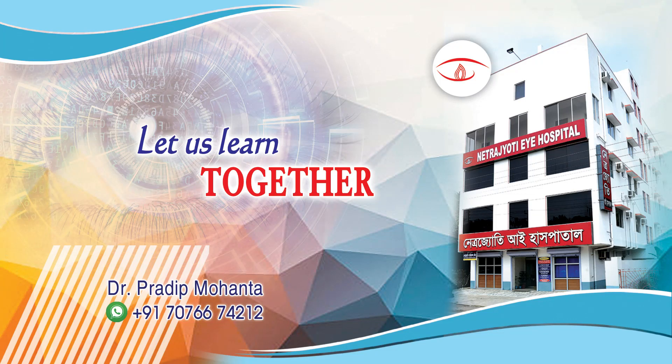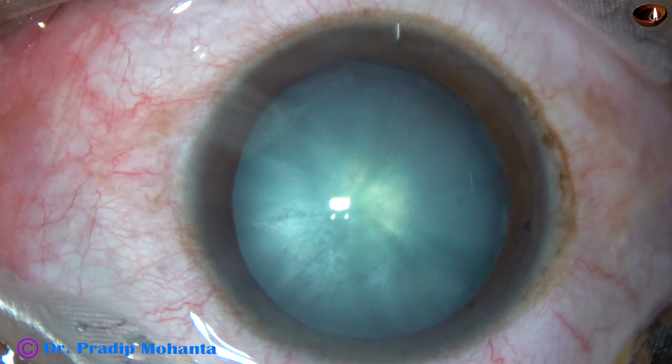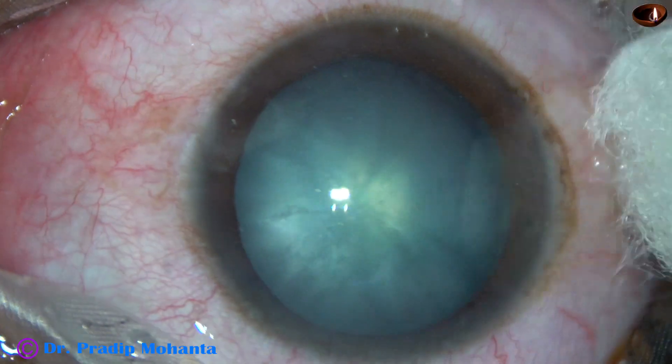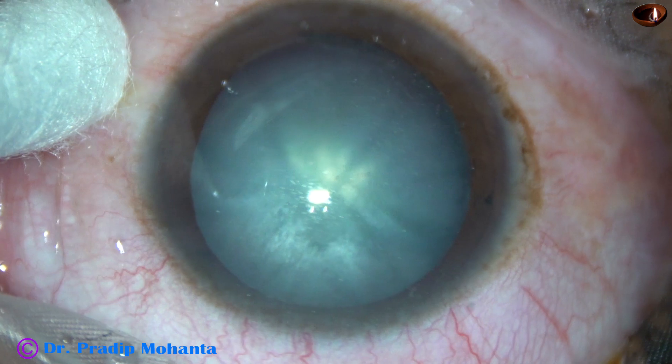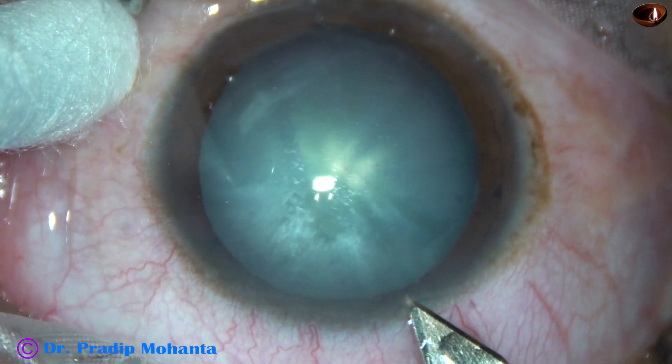Friends, welcome to my workplace at Rana Gahat, West Bengal, India. This is a soft intumescent cataract. Rhexis ran out in this case. Let us observe this surgery. This is a totally unedited surgery and you are watching each and every step of this surgery.